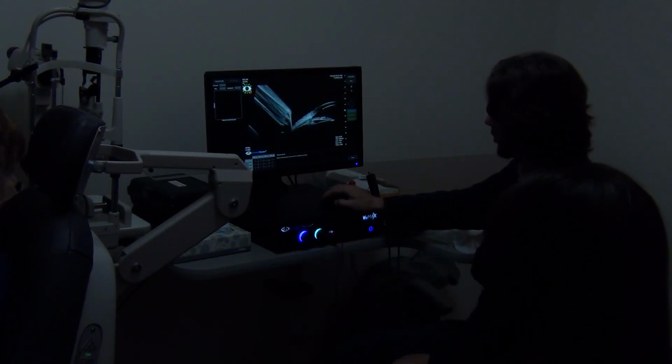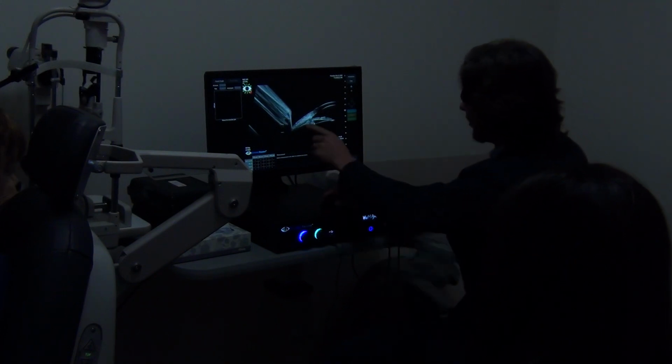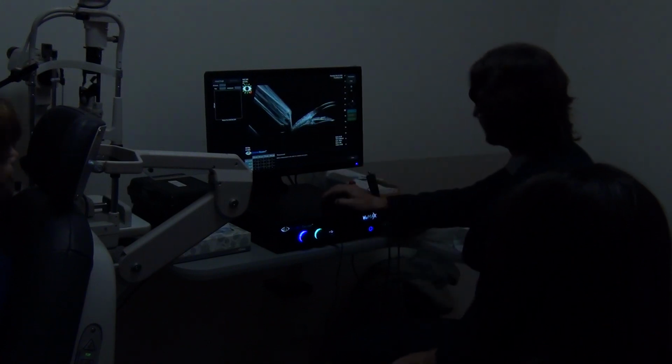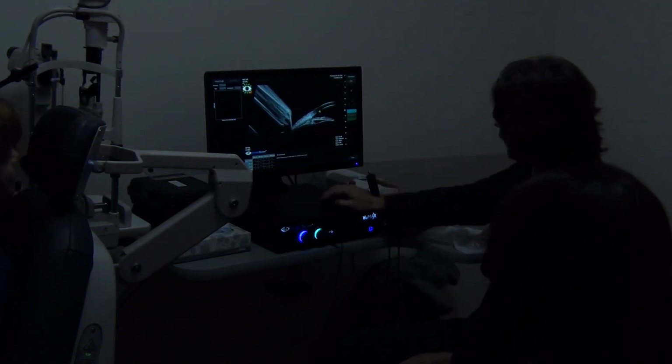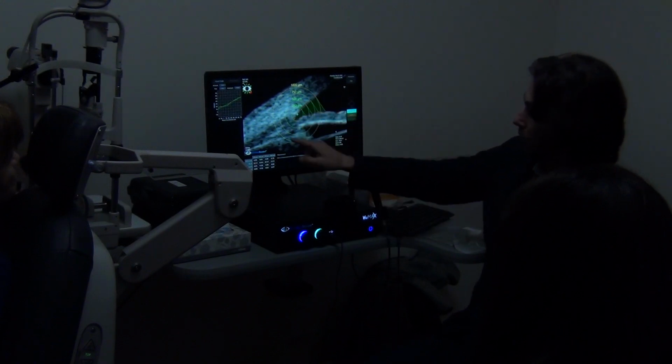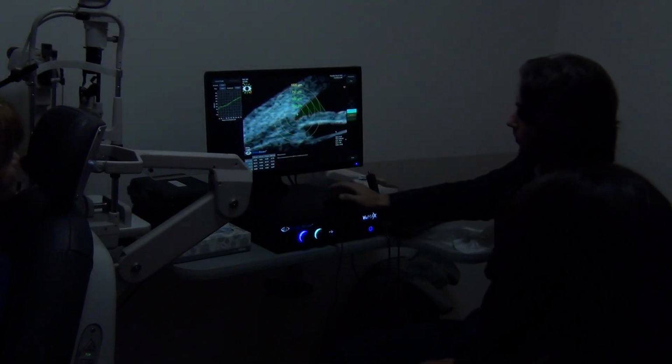And it's usually a junction right here. But you kind of draw an invisible line, and that's the mid-up point. So we take the blue cross, and we come to our scleral spur. And the unit will provide you angle details with the nomogram.